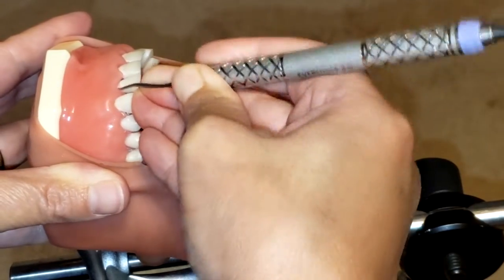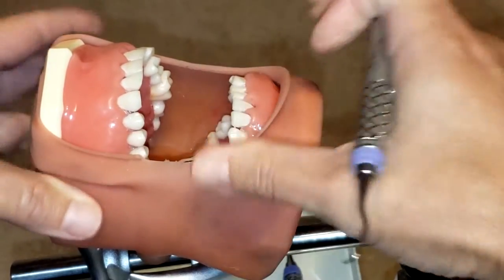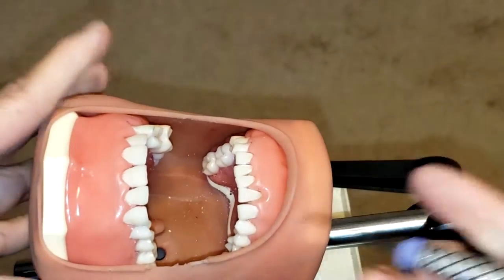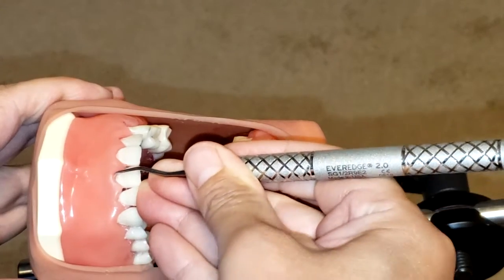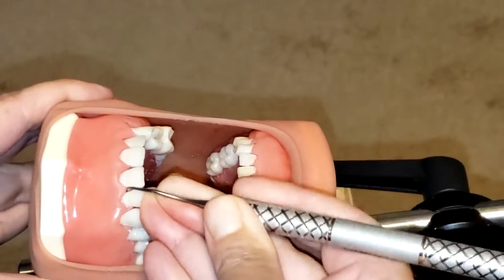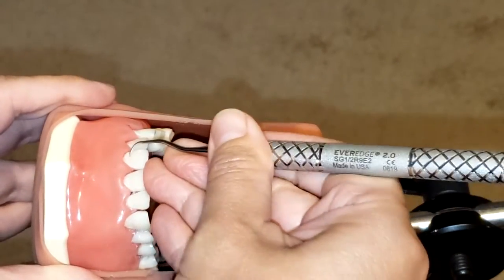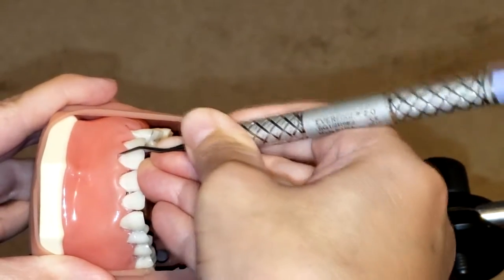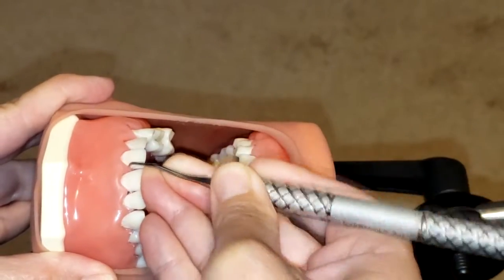Maintaining that 70 to 80-degree angulation allows you to remove the calculus adequately. Rock on your fulcrum. Again, start at the midline, apply lateral pressure, and make sure your toe-third is fully adapted to the tooth — the toe-third must always be adapted to the tooth so that you do not lacerate the tissue.